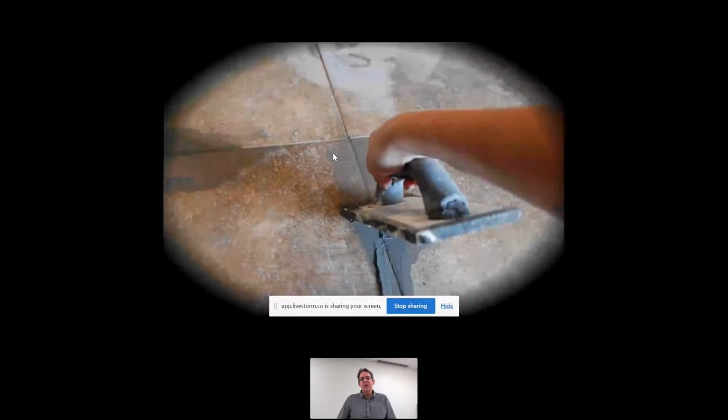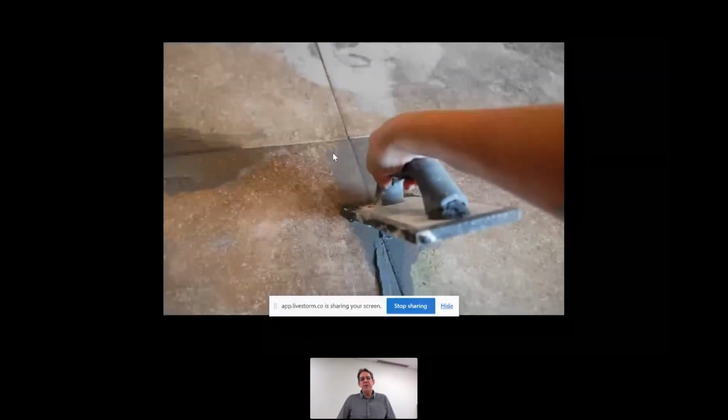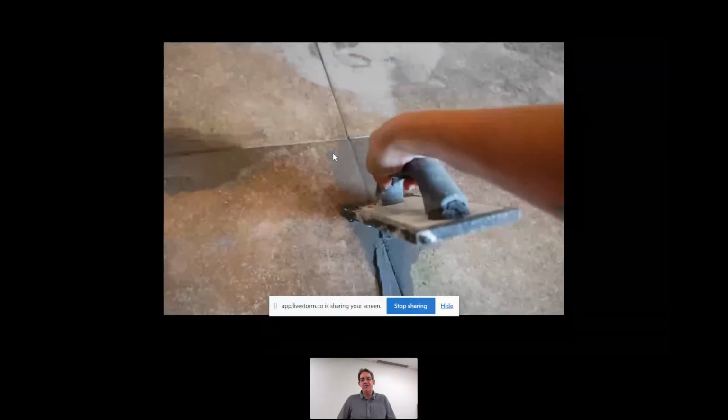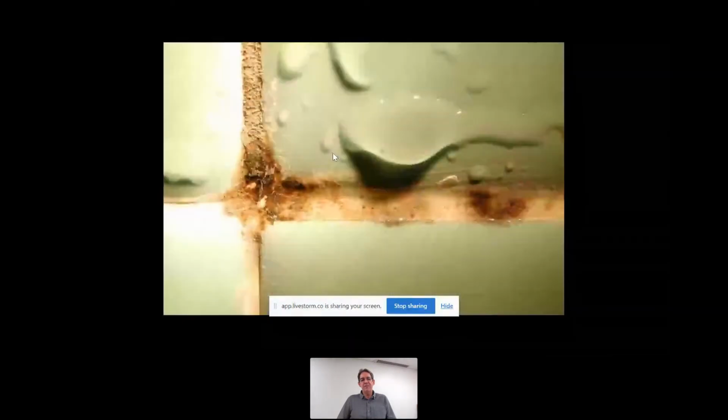And hence, the analogy that I use is if you put in tile in your kitchen or your bathroom, if you put that tile too far apart, what happens to that grout? What happens to that cement after a period of time? This is what happens, right? Because remember, we've got more bacteria in the oral cavity than anywhere else in the human anatomy, and that bacteria is very, very acidic. And eventually what it will do is it will start breaking that cement down.